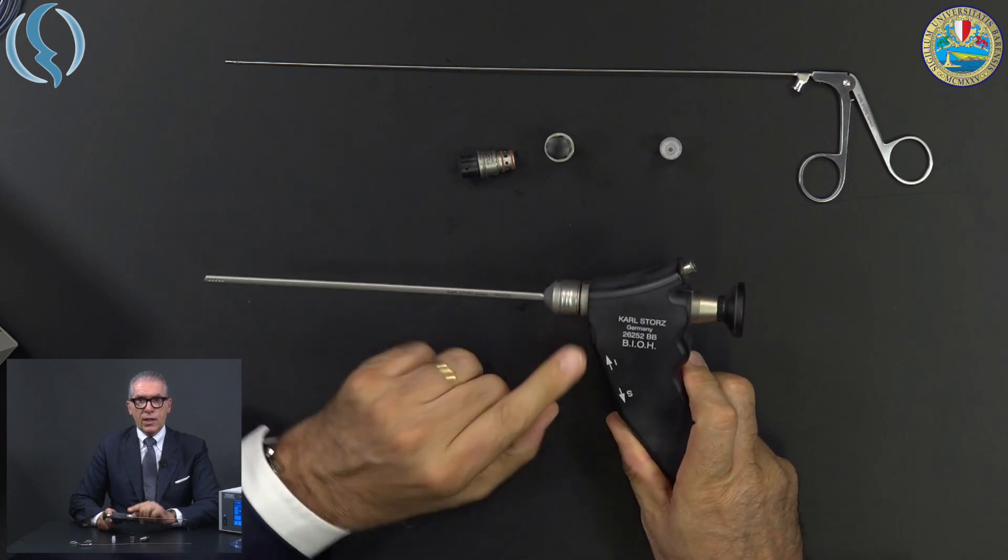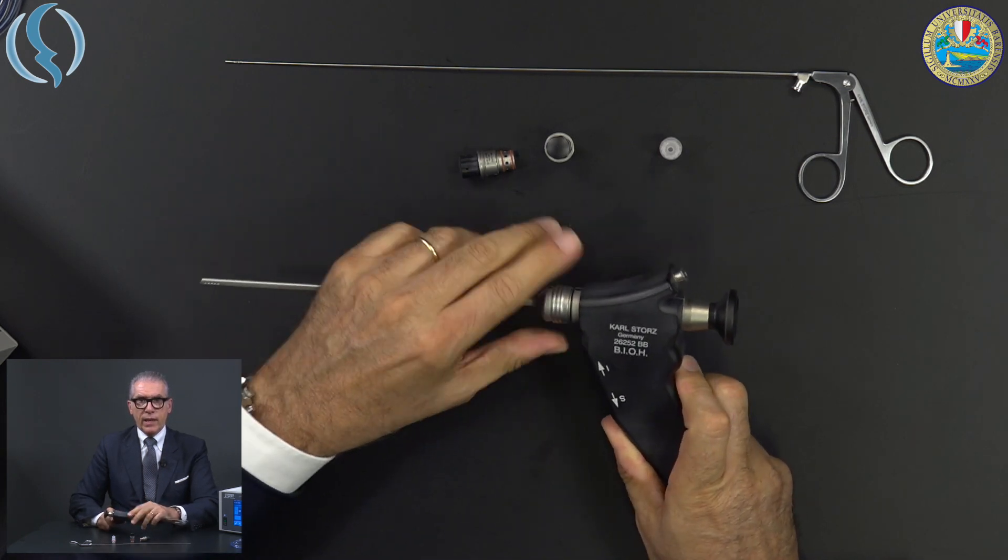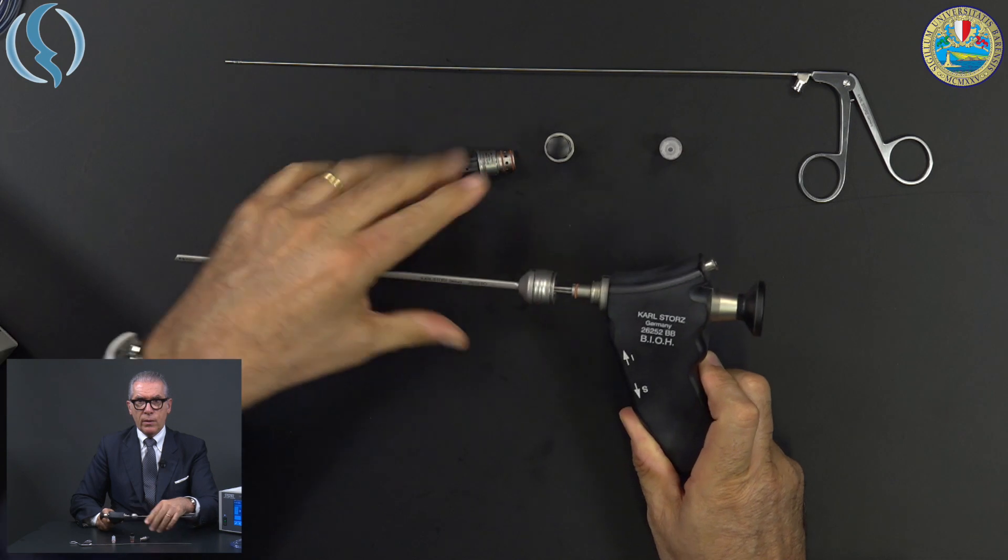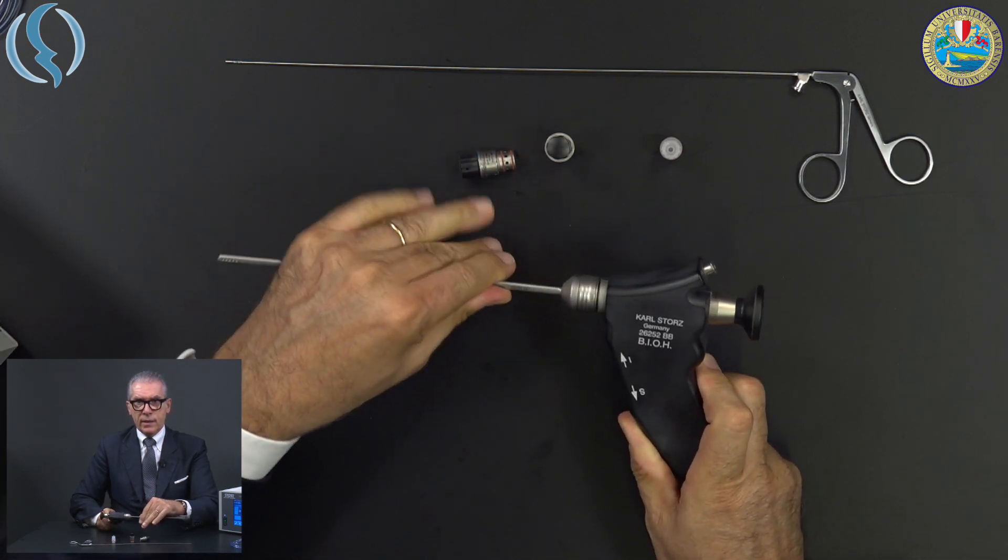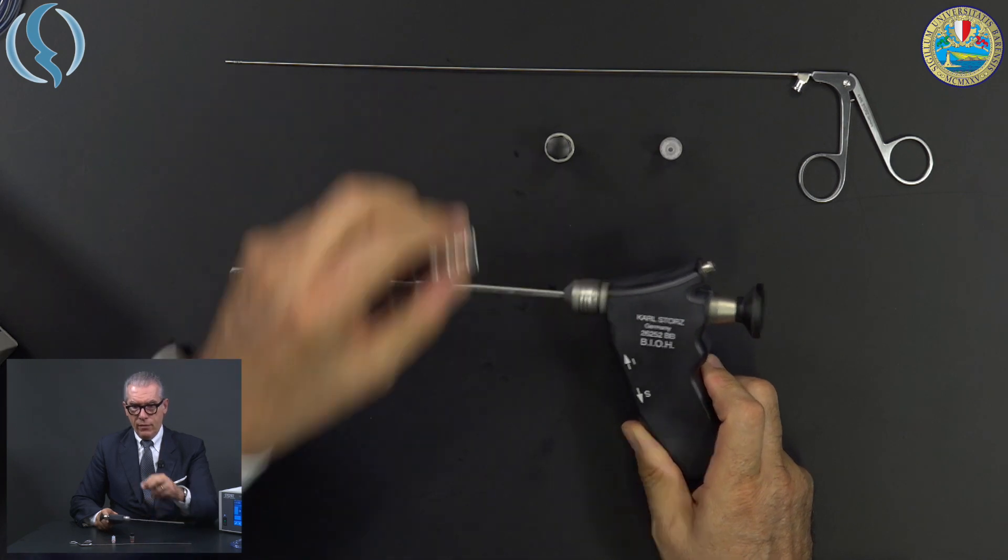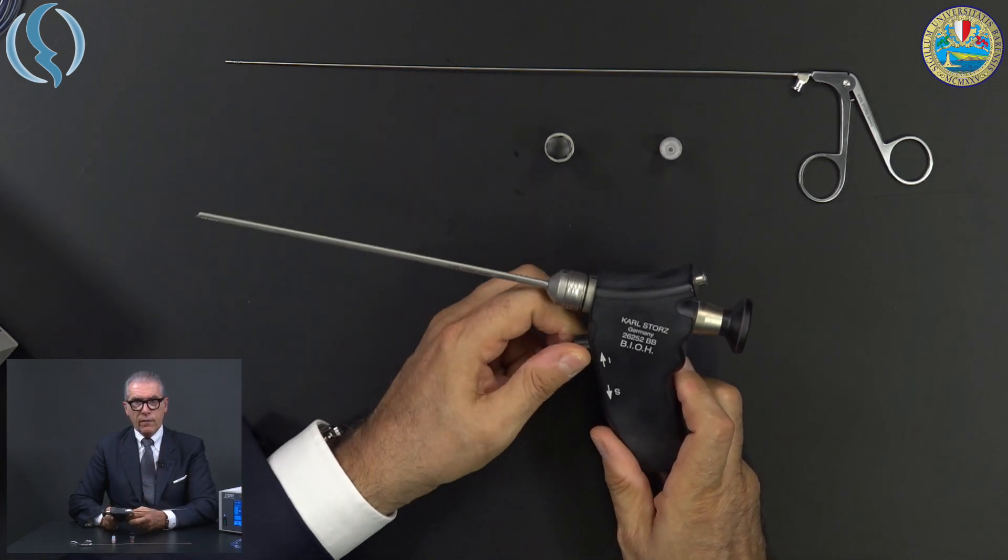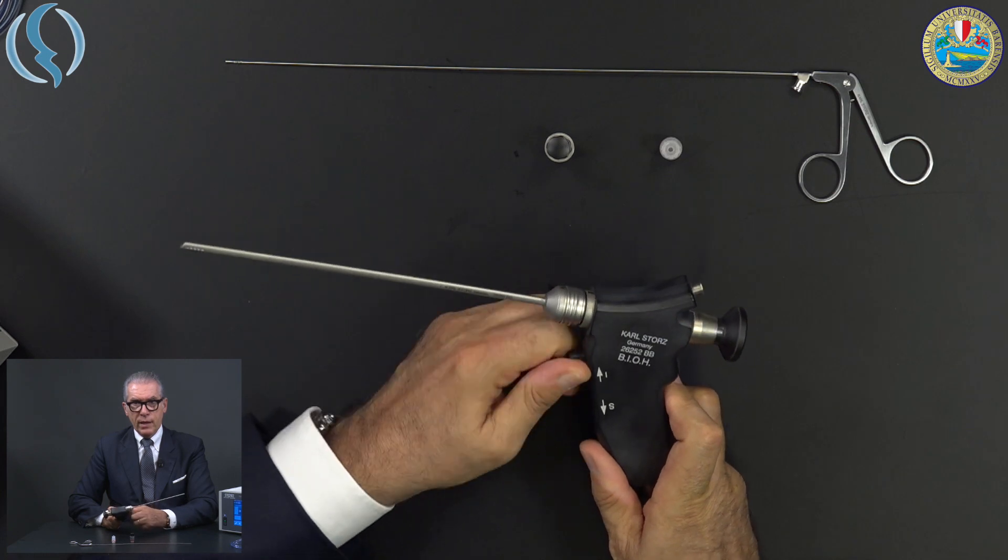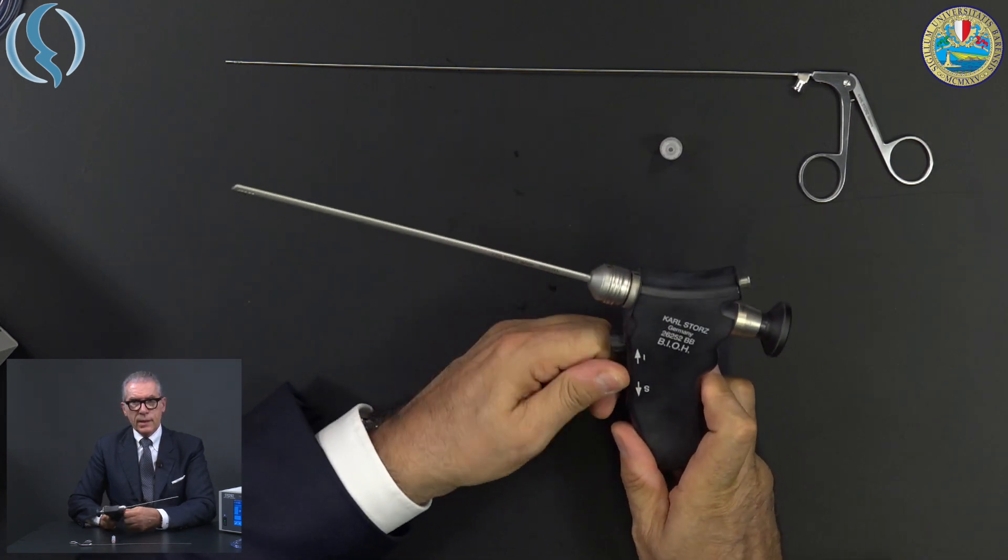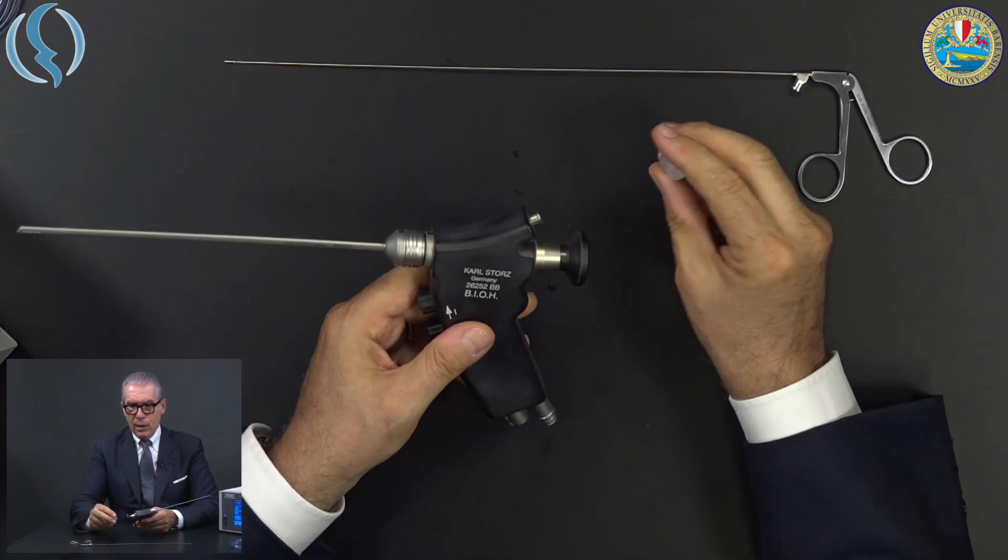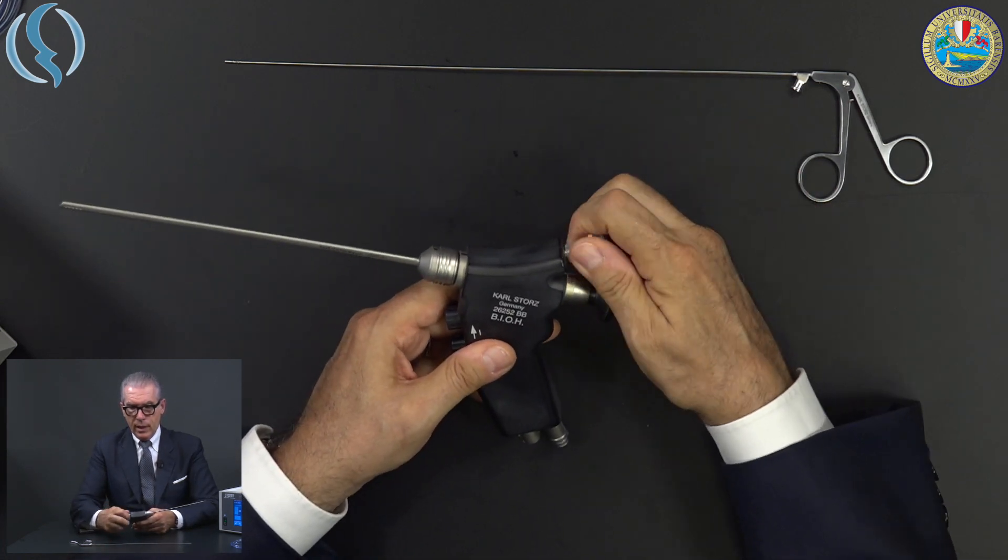You see this is the sheath with the new mechanism, very easy to use and very stable, like a click line system. Then we have our valves with the screw like this. And finally our rubber seals, our automatic valve.